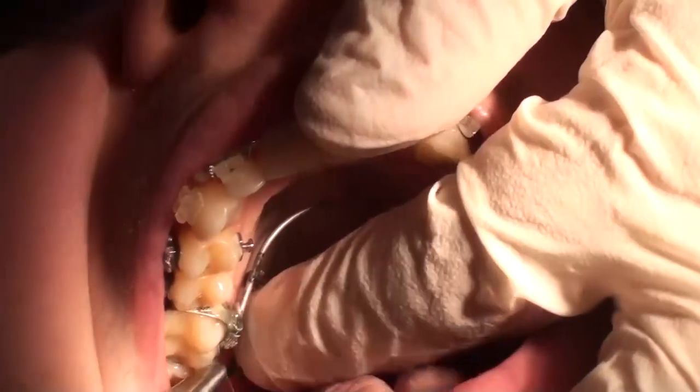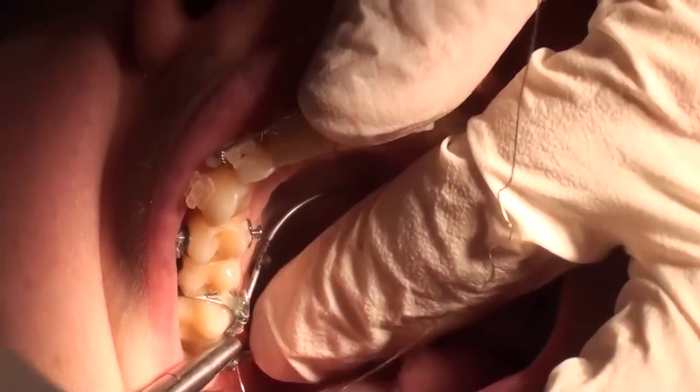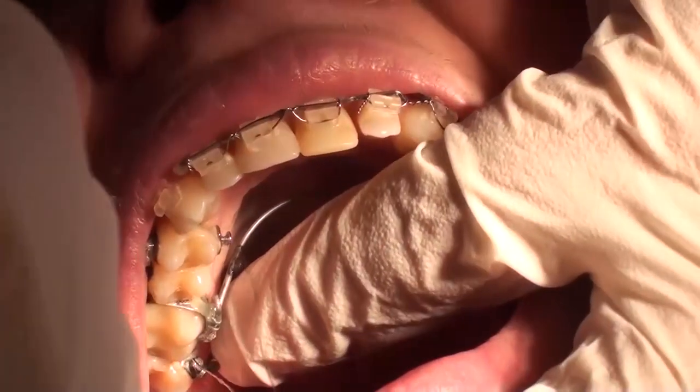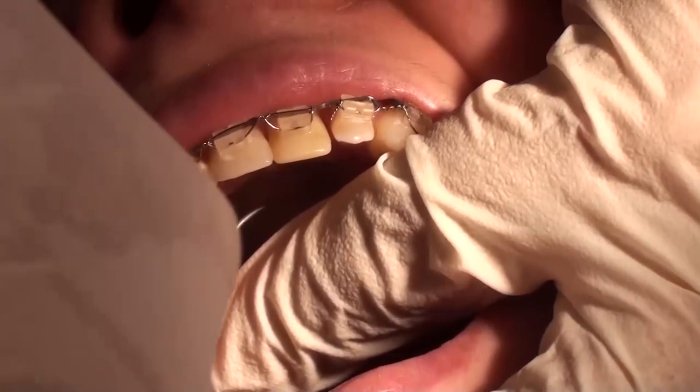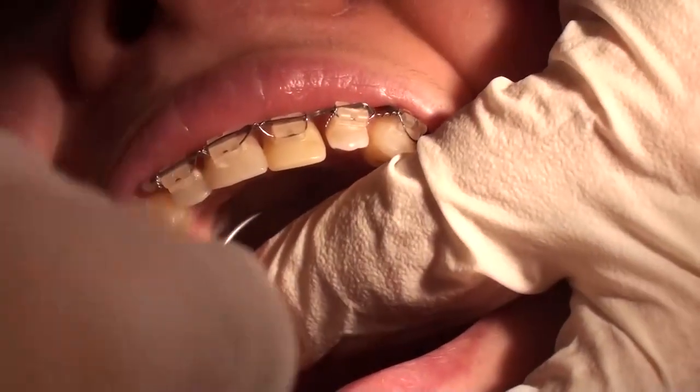Now the cantilever is ligated again to the palatal button, so that this very gentle force — really just a few grams — is applied to the molar, stabilizing its position.